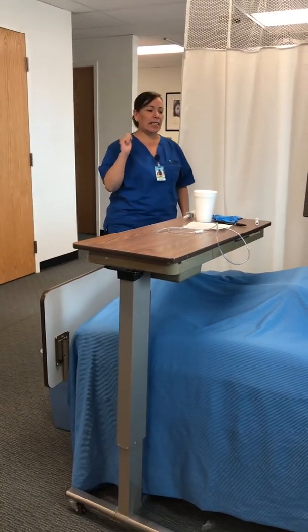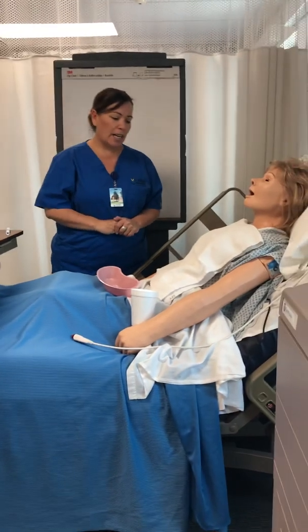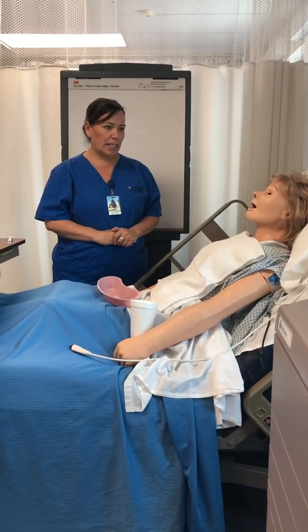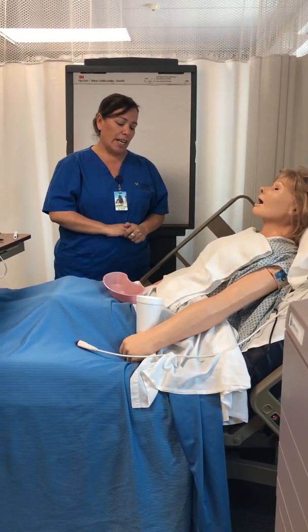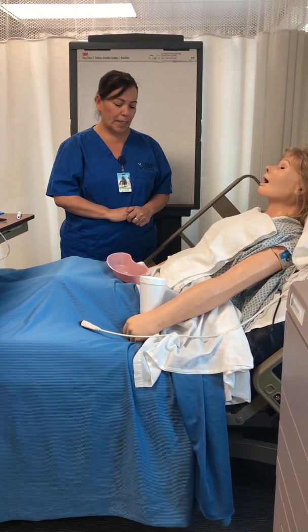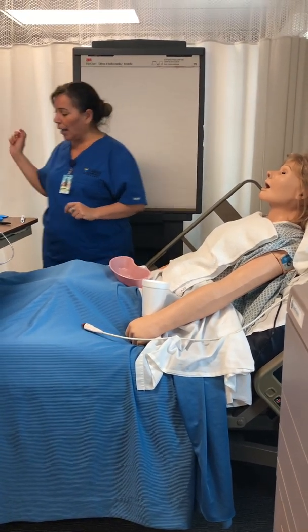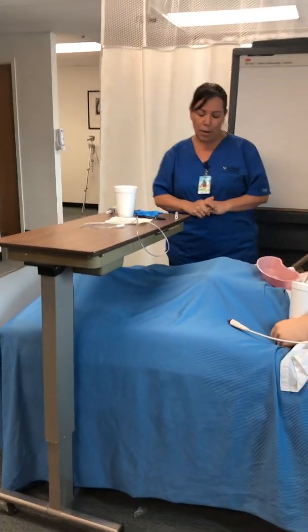Knock, knock. My name is Judith Sanchez, and I'm a student nurse at LCC, Lamar Community College, and I'm here to put an NG tube. Is that okay with you? Okay, so then I close the curtain for privacy.